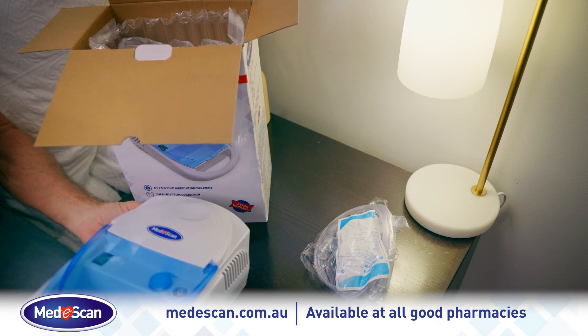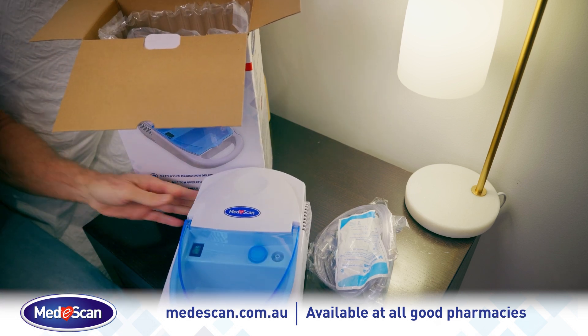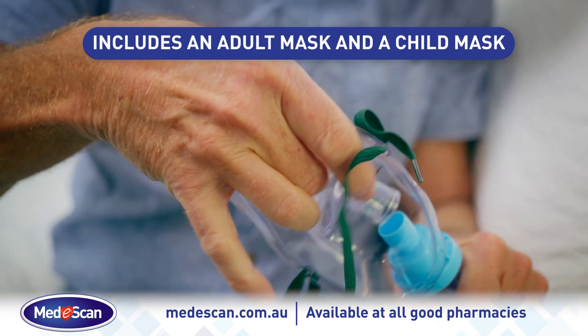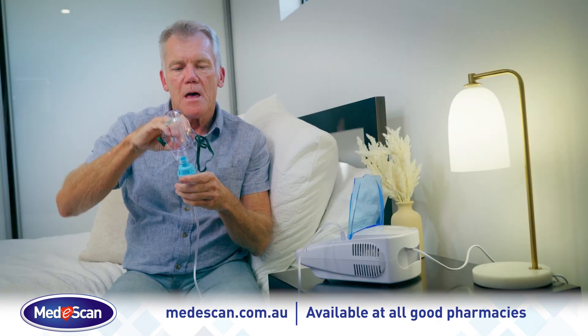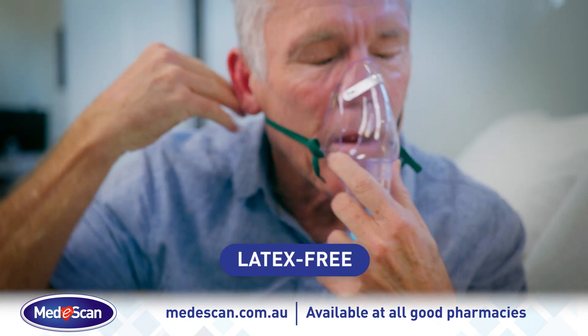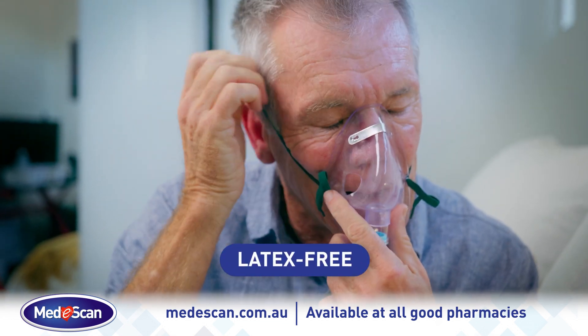The complete MediScan nebuliser device and kit includes two face masks, an adult mask and a child mask, and an optional mouthpiece, making it suitable for all ages. It comes with two storage compartments and it's latex-free for added safety.